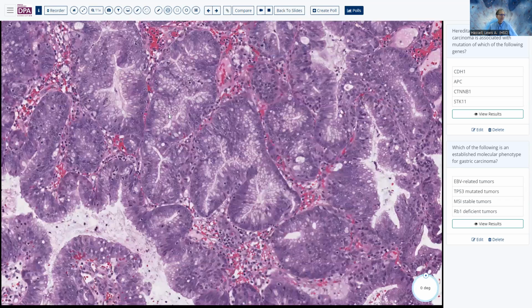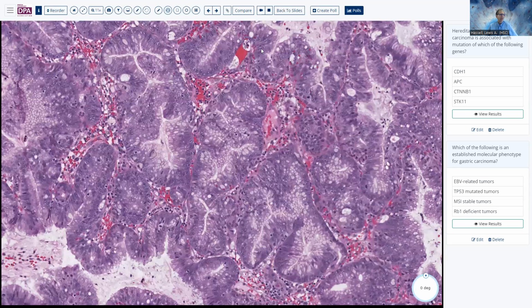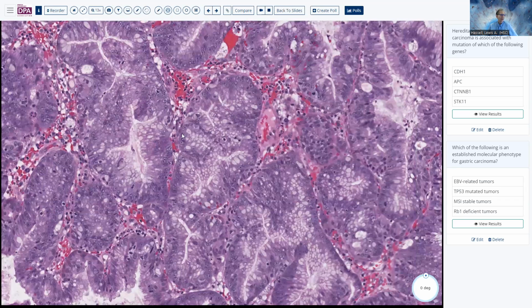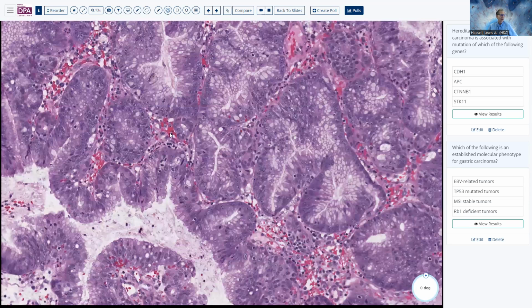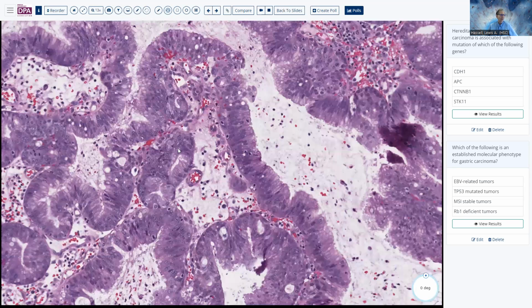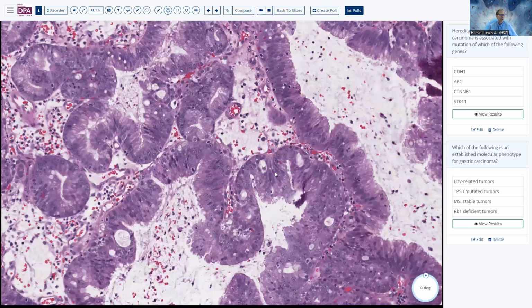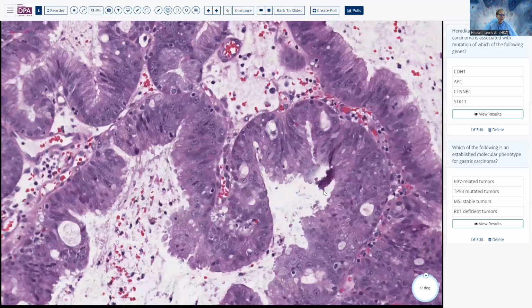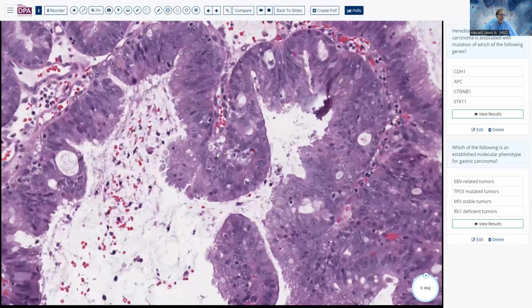And this one is somewhat unique because of this vacuolar appearance in areas. And as you come back and search around in these areas, I think you'll begin to see that there are areas where we have atypical cells like this one or like this one, that are occurring in this epithelial compartment.